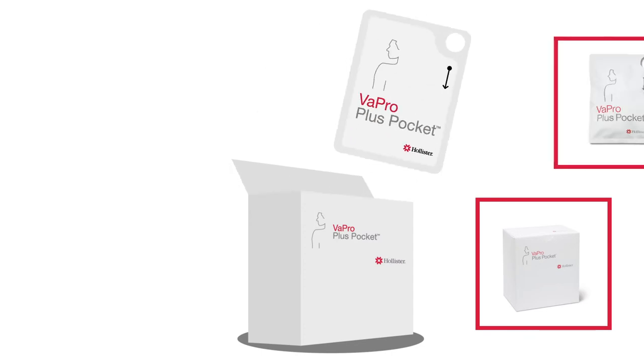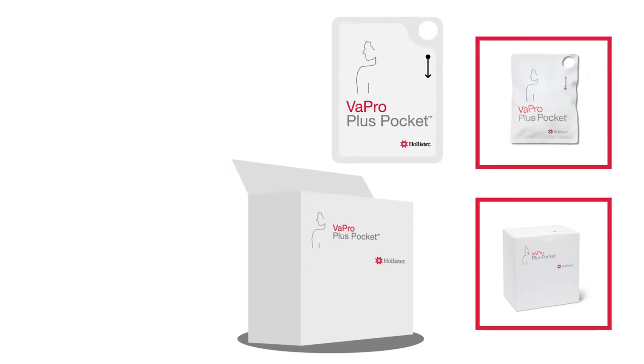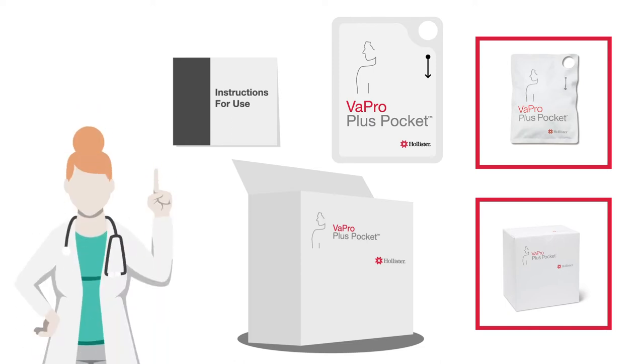Before opening the packaging of the VaPro Plus Pocket catheter, you need to read the instructions for use that are included in every box. Remember to always follow the instructions that you have received from your healthcare professional.